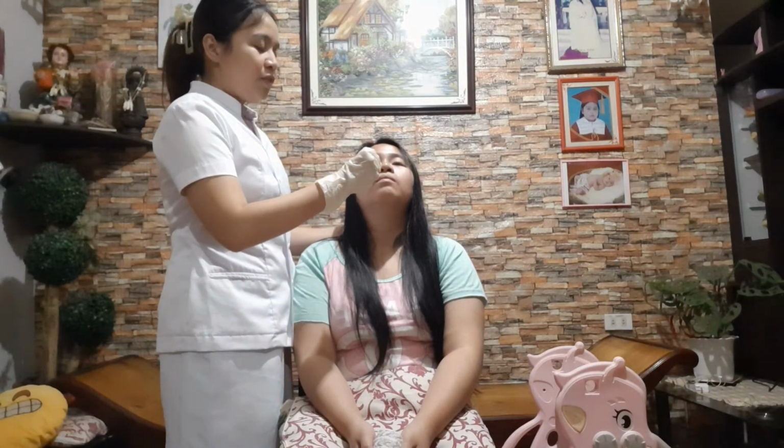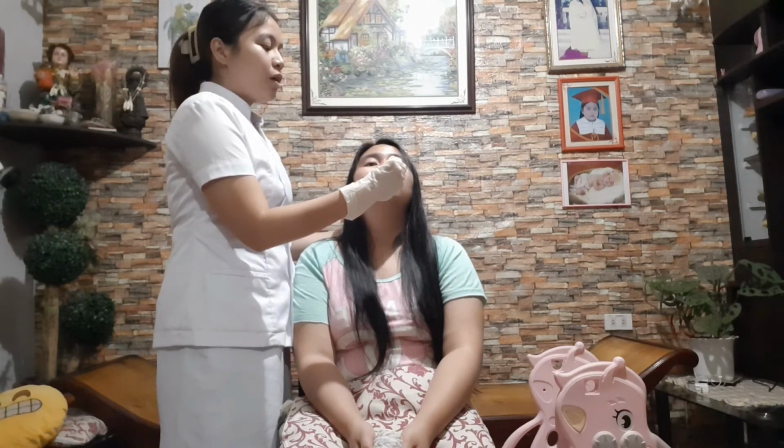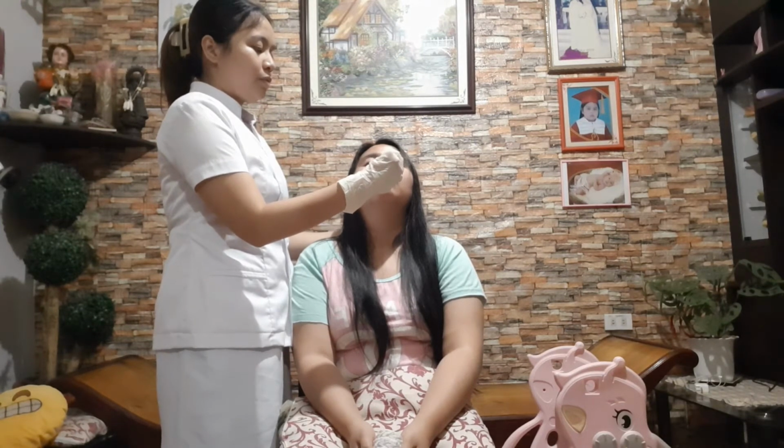2, and 3. And then insert it to the other nares for accurate result and to make sure that we will attain the right specimen needed. So we will insert 2 centimeter again, and then rotate anterior mucosa 3 seconds to 5 seconds. Depends on the policy. 1, 2, 3. Doing this procedure will ensure accurate result.